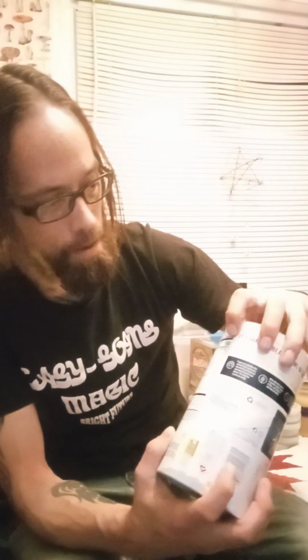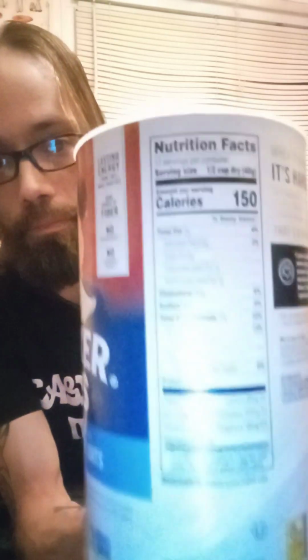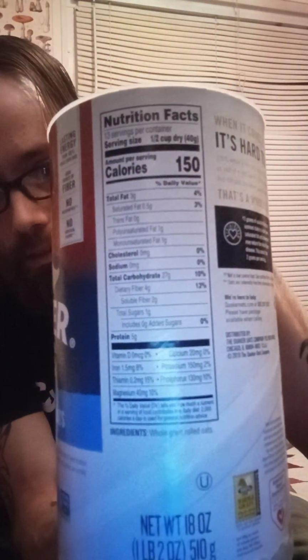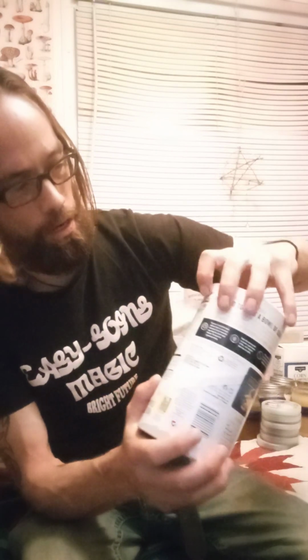Per 40 grams. So we're just going to double all this and we'll be close to the 100-gram mark. So I'll put this up there, and then I'll go through, state what it is, and then double. Okay, 150 calories per 40 grams, so per 80 grams, it's 300 calories. That's a good bit for the mycelium to eat.